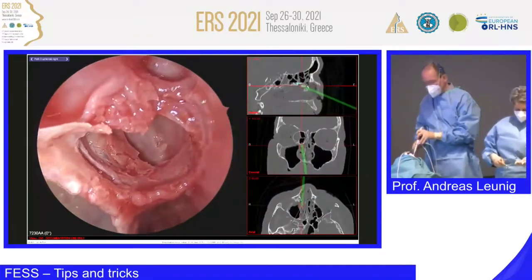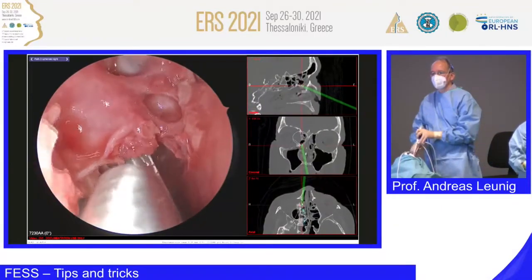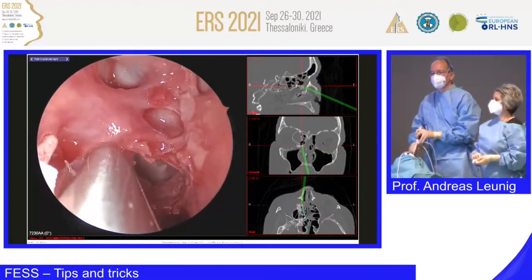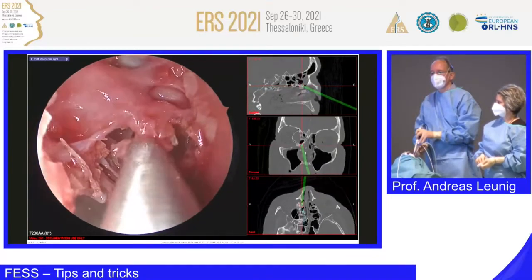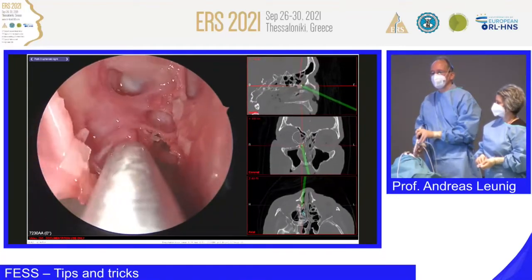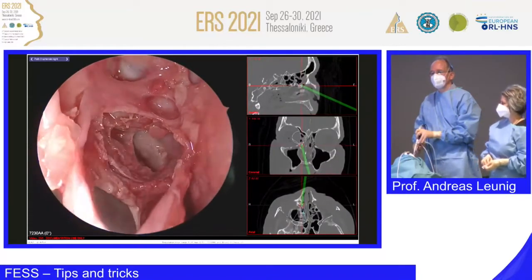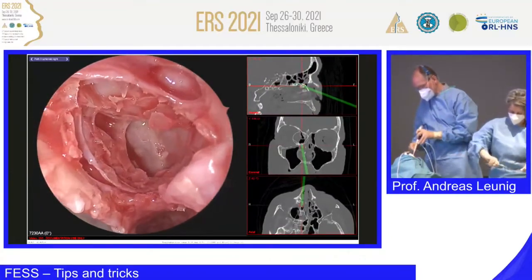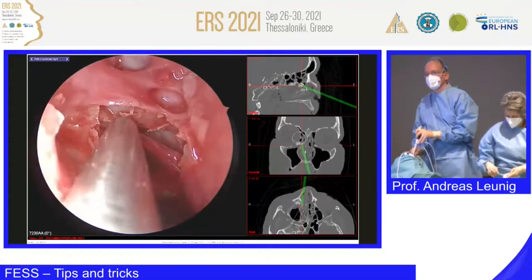Now we are facing a space where we have to orientate where we are. I'm resecting a little bit more of this here. You have to keep in mind the anterior skull base is coming down the most in the more posterior part, so be aware that you can be much earlier at the level of the skull base. I tear a little bit of mucosa. This happens during surgery as well, but be patient and this shouldn't be a problem. Now I'm cleaning a bit more.